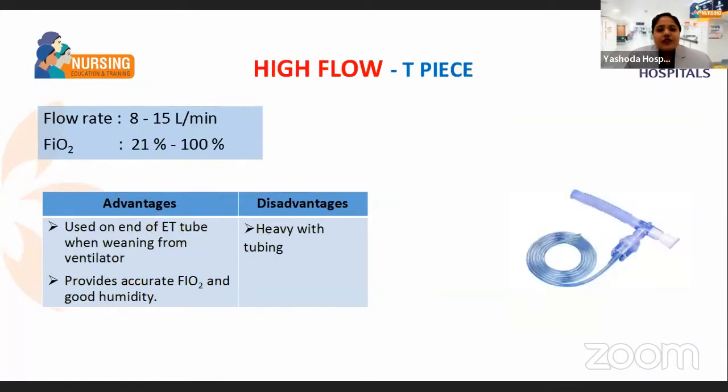The next one is the T-piece. I think everyone might know about this T-piece. When will you actually use it? When the doctor is planning for extubation, first the doctor will place the patient on the T-piece, either on tracheostomy or on ET ventilation. So the T-piece is preferable.